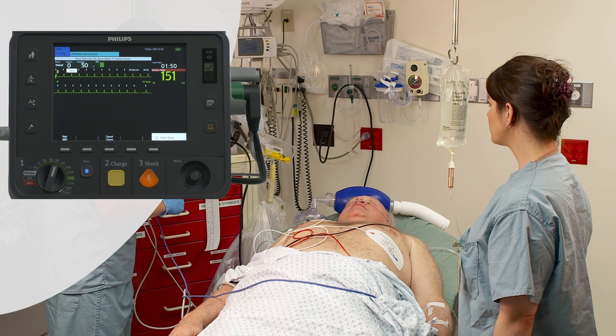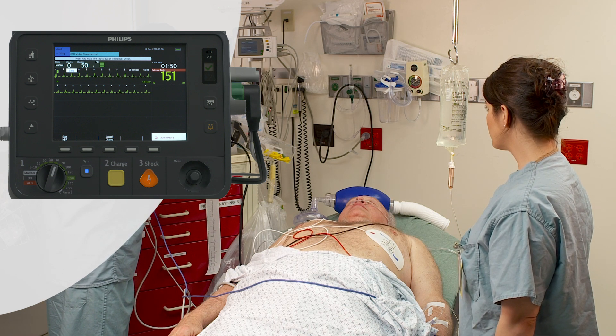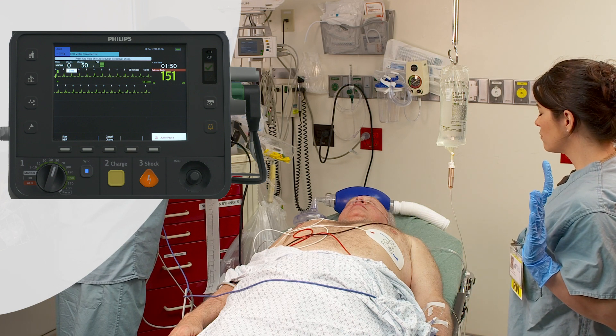With synchronized cardioversion, you deliver a shock synchronized to the R-wave of the ECG being monitored in Wave Sector 1.